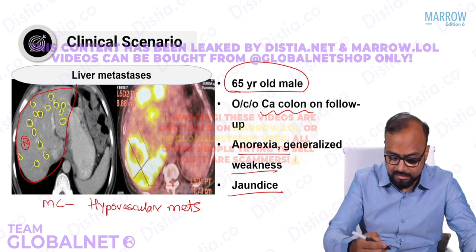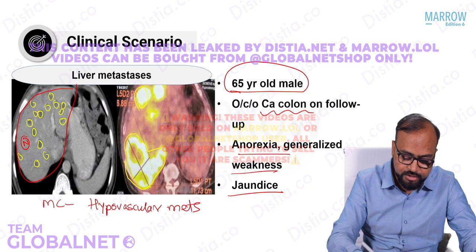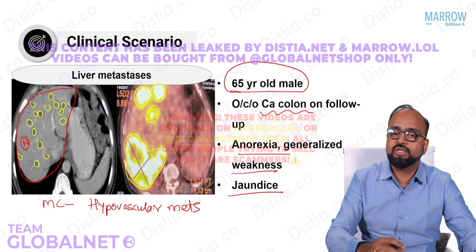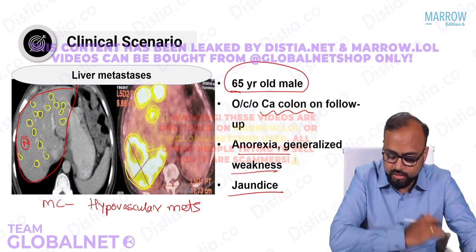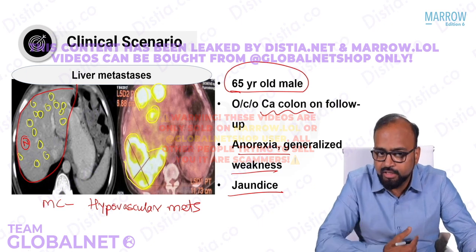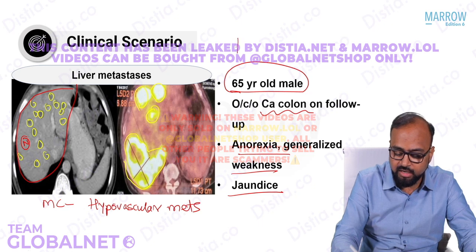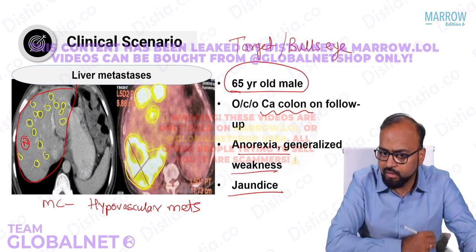When we did a PET scan, multiple of these lesions were showing extremely high metabolic uptake of FDG. That is what is used in PET scan because glucose uptake is high in tumors, right? So they are showing hot spots in the areas of the deposits. This is how liver metastasis would usually present. Most common primary for liver mets is usually CA colon, as in this particular case. On ultrasound, they sometimes give rise to a bull's eye or target appearance.